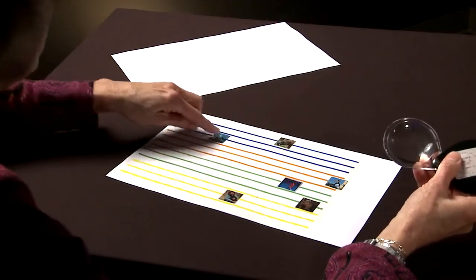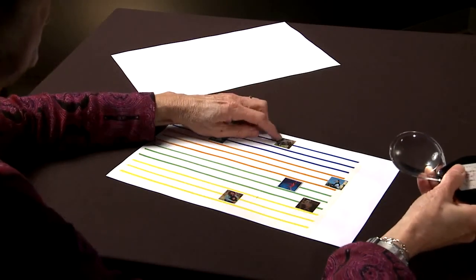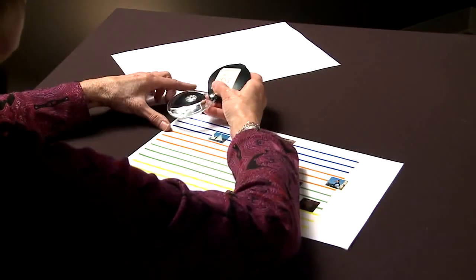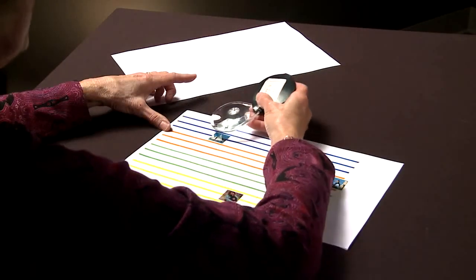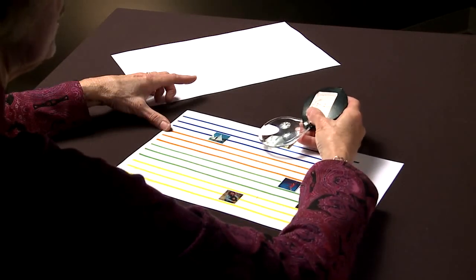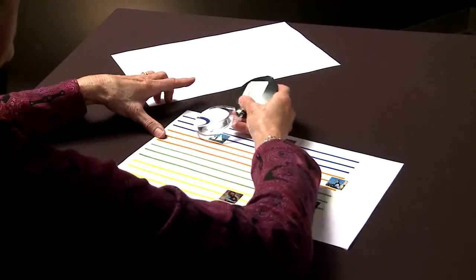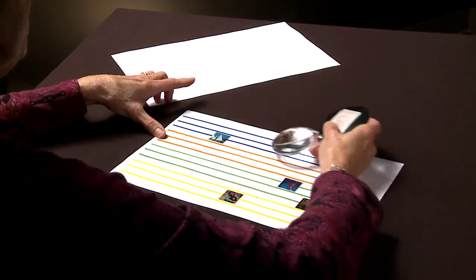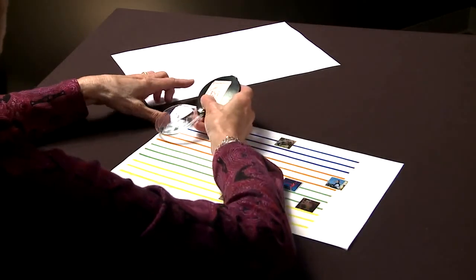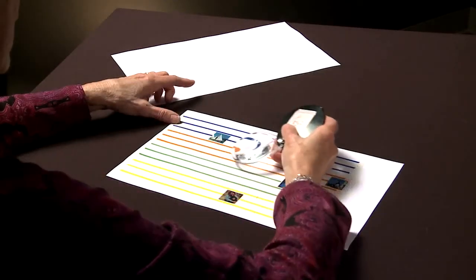And somewhere on these lines is a little bitty picture that at the time I pulled from children's magazines, but you can use any little picture or sticker. And you're going to want them to scan from left to right, tell you what the picture is. So this is also picture identification. Keep going until the end of the line, return back to the left, and keep scanning. You do want them to build speed as they do this, and so just encourage them to move as quickly as they can, staying on the line.